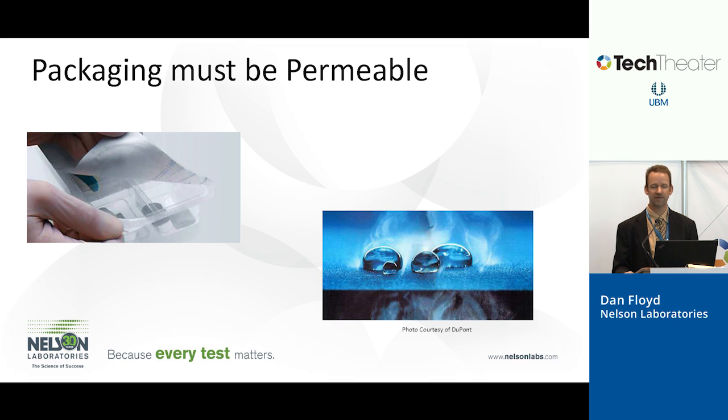So the thing with ethylene oxide sterilization, there's a number of vacuum and pressure changes. So you'll pull a deep vacuum, you'll allow air to come back in, you'll do that multiple times because at the end of the cycle, you have to get all of that ethylene oxide back out of the product. So you're going to pull multiple vacuums, so the pressure changes, the package has to be able to withstand that.